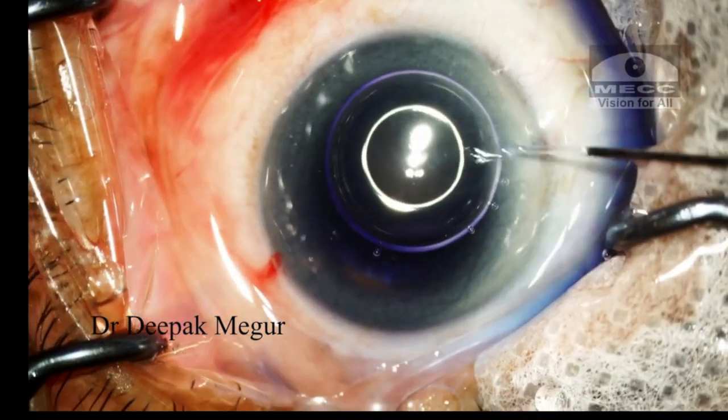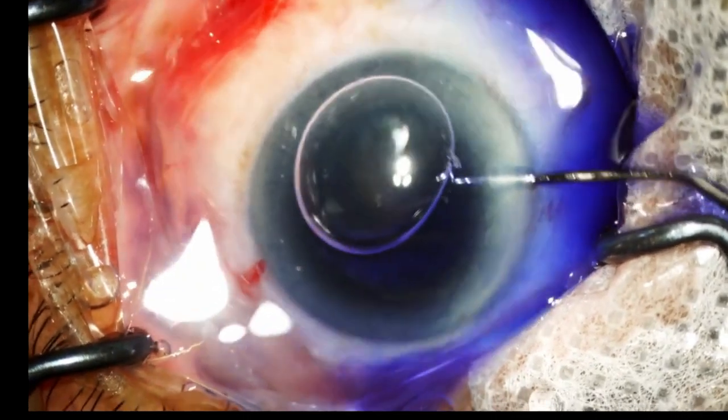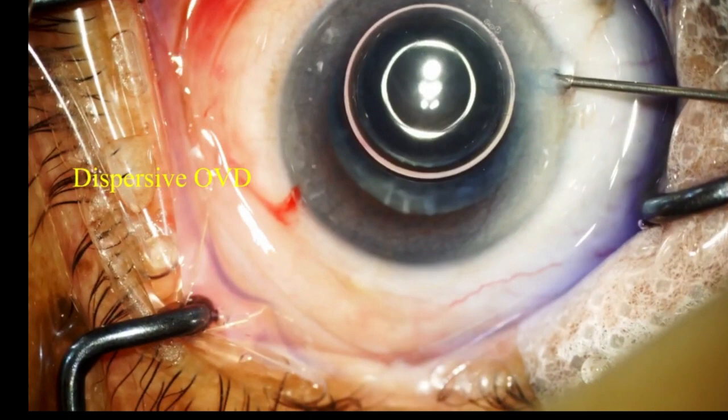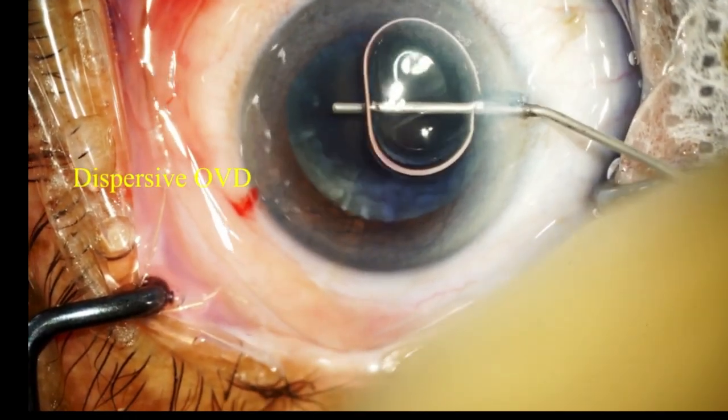After making the side port, I'm staining with trypan blue. Visualization is challenging in these brown and black cataracts as there's limited contrast. I'm using a dispersive OVD, which is a mix of chondroitin sulfate and sodium hyaluronate.